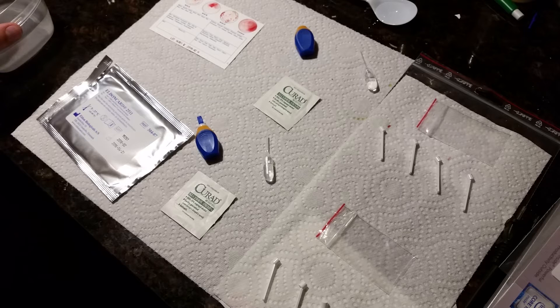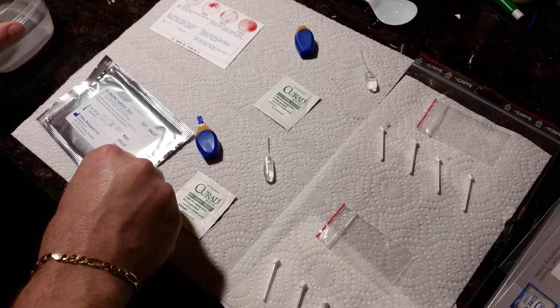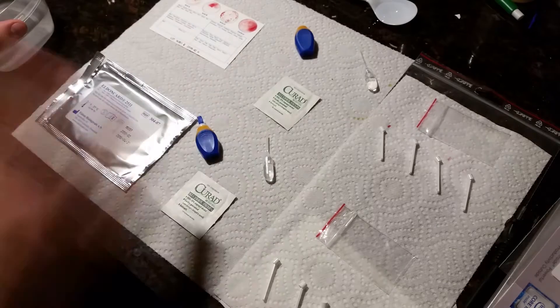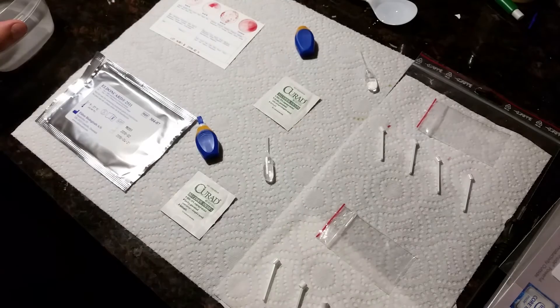Who knows — maybe I had some really spicy food and it messed with my blood coagulation last night. Or maybe the alcohol content from going out could mess with coagulation. This is chemistry, and it's good to verify your results.